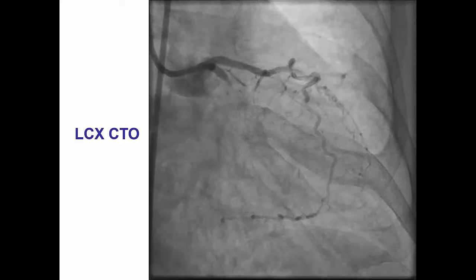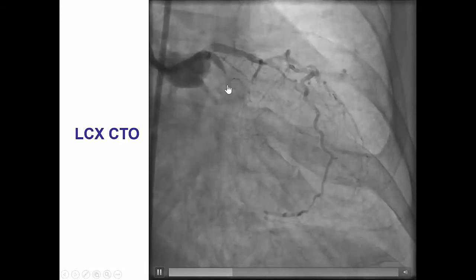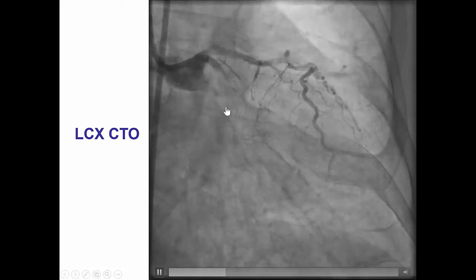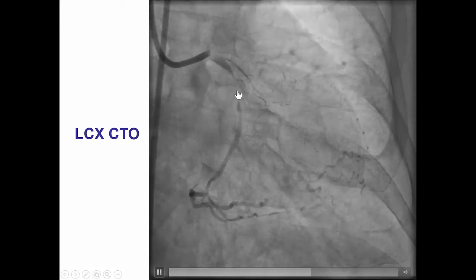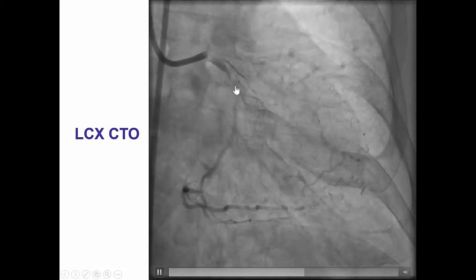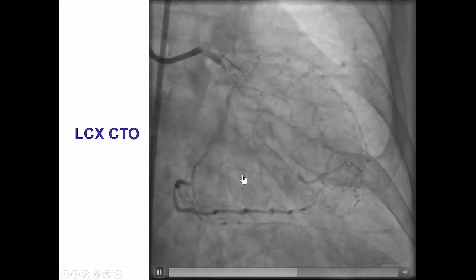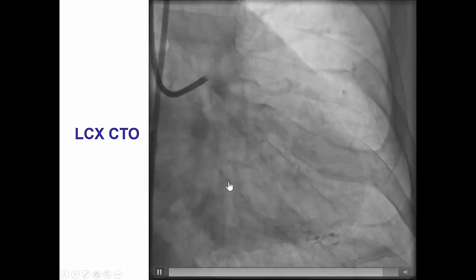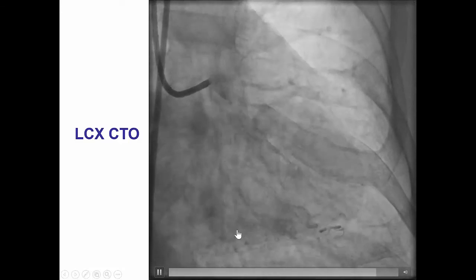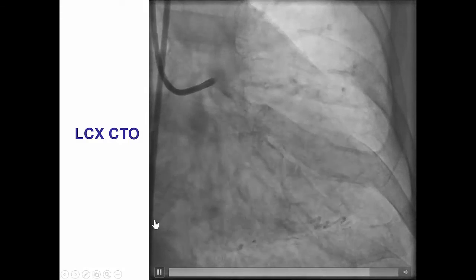Diagnostic angiography demonstrates a proximal circumflex occlusion. It has a nice tapered entry and is relatively short. However, there is a bifurcation on the distal cap with a large obtuse marginal branch as well as the distal circumflex reconstituting at the distal cap. The collaterals, as is the case in most circumflex CTOs, are epicardial, coming mainly from the distal left anterior descending artery, and they could potentially be used, but they are small and tortuous.